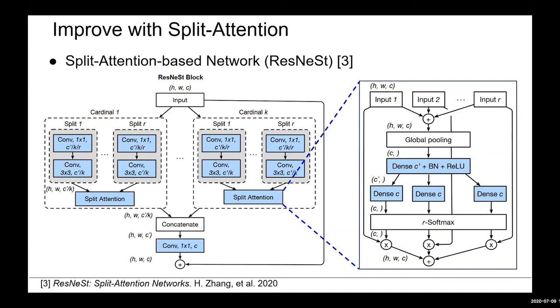The split attention module integrates the information from the radix to generate a probability distribution by the softmax operation. This probability is then used as the soft assignment weights of the split attention. According to the literature, ResNeSt outperforms the ResNet backbone in various CV tasks, and it achieves state-of-the-art performance in object detection by transferring the backbone from the ImageNet tasks. However, the cost is an overhead in the number of parameters and GFLOPs, but in an acceptable range.